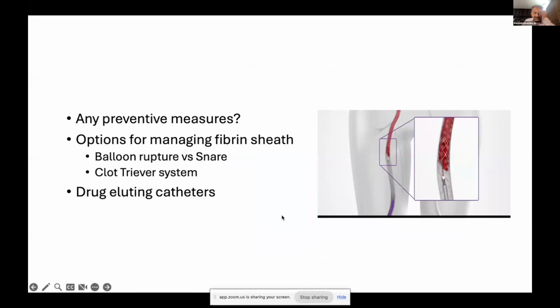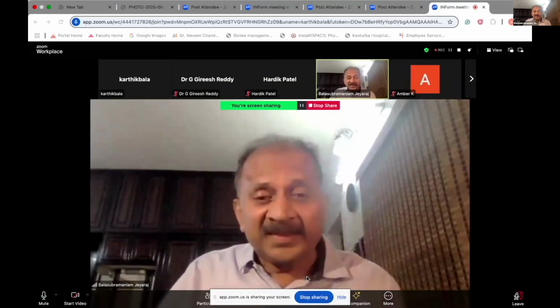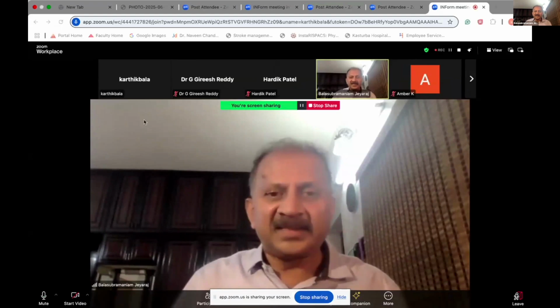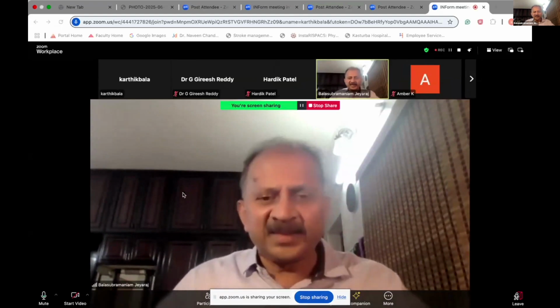Yeah, thank you, Karthik. Actually, this is the case which I had written in that book by Dr. Kashi. This man had both femorals absolutely blocked. This was all done outside. He came to me for an access creation 4 years back with all the possibilities closed. With this as the index case only, I wrote that chapter. Both the AVF, both the BCF, shunts, and both femorals, both jugulars.